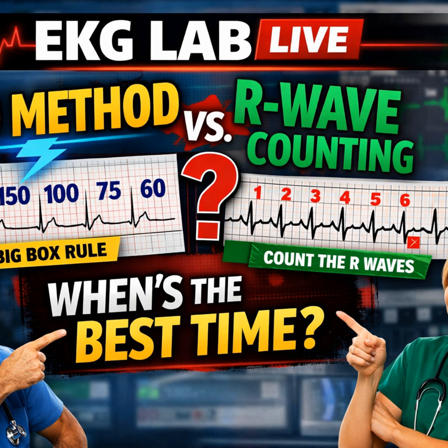I accept that A-Fib is the Achilles heel of the big box method. I do. But I'm not convinced that one exception, even a common one, invalidates the rule. The majority of diagnostic clues in EKG interpretation come from regular patterns. You're calling the most common arrhythmia in the world an exception? In terms of diagnostic mechanics, yes.